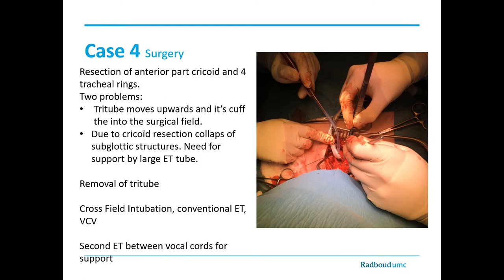During this case, there were a couple of problems. One problem was that Tritube's position was a little bit unstable. It kept on moving upwards, and then the cuff moved into the surgical field. That was very difficult for the surgeon, so he kept on pushing it a little bit back.